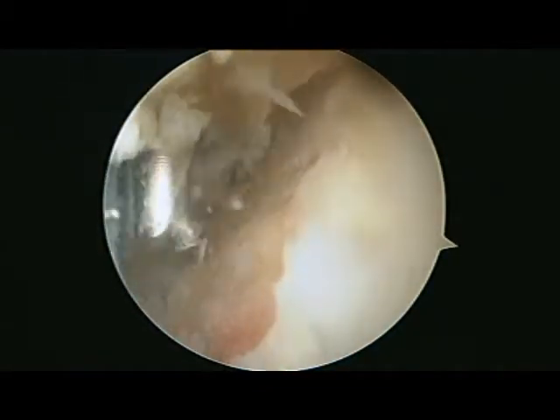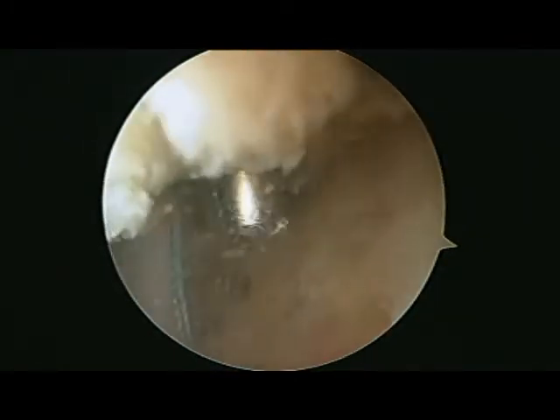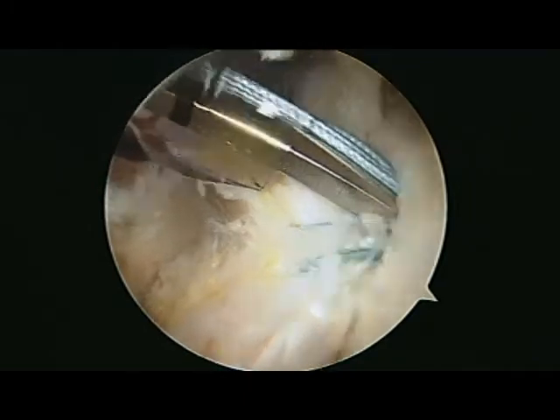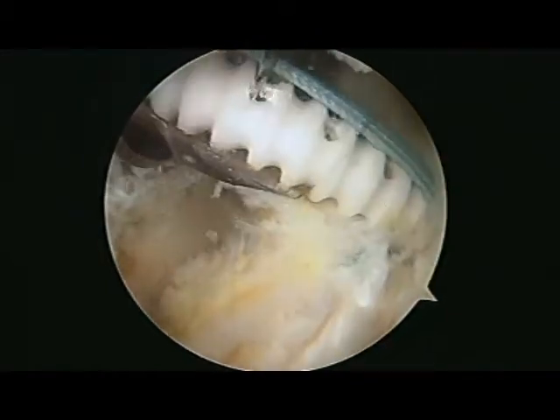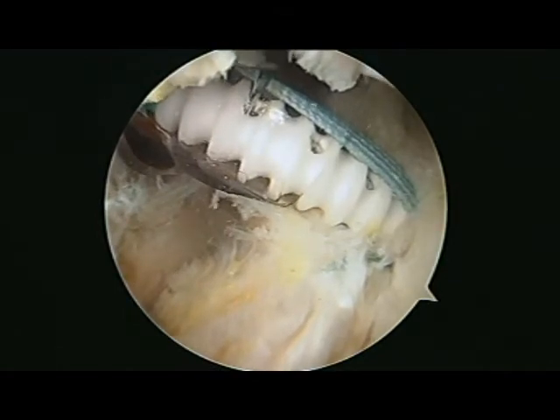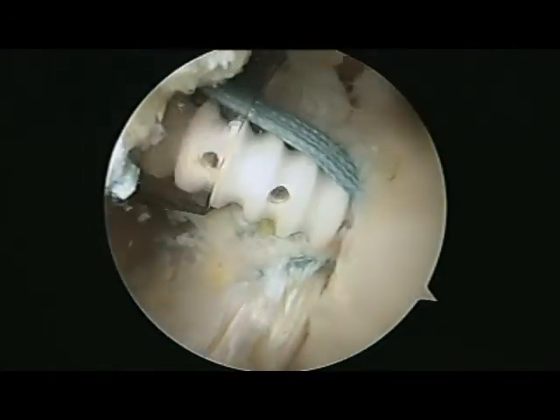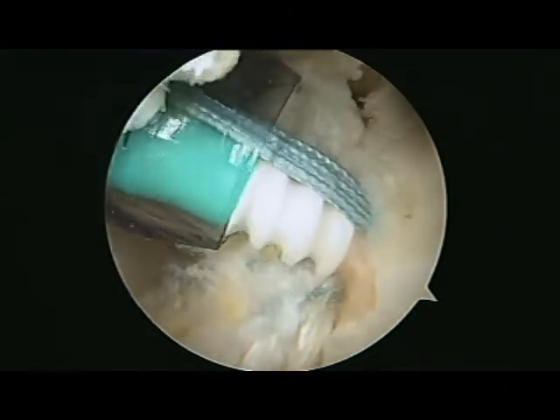Once I've got that bone prepped, you can see I already have the sutures in the tendon — those little blue threads there. I'm going to take those threads and incorporate them into a suture anchor. I've made a pilot hole; that metal thing is the guide for my screw. That's the screw coming in that incorporates those sutures, which are through the subscapularis tendon. I'll screw that suture anchor into the pilot hole, holding those sutures in the tendon in place, effectively holding the subscapularis onto the bone until Mother Nature heals it there.